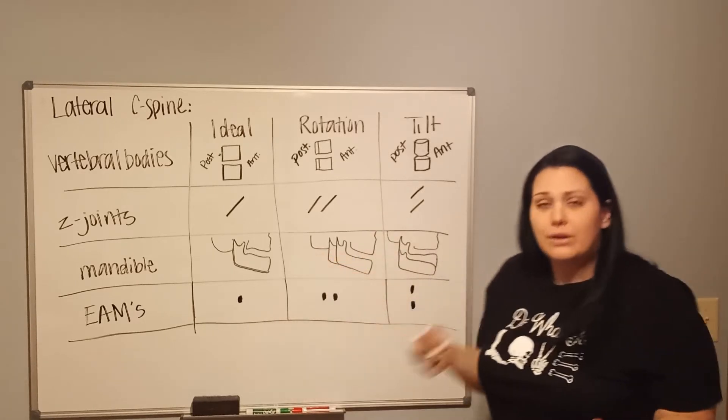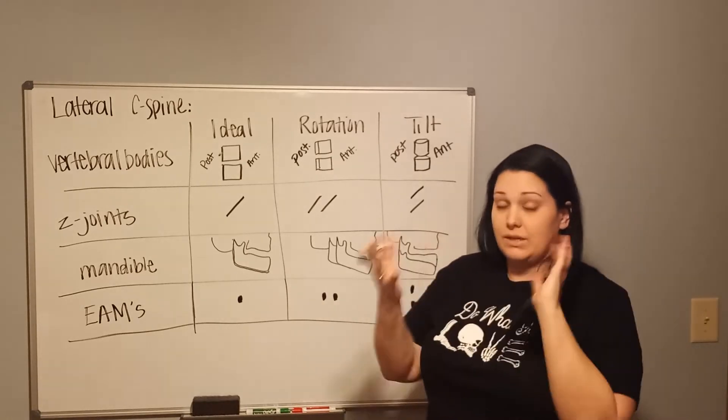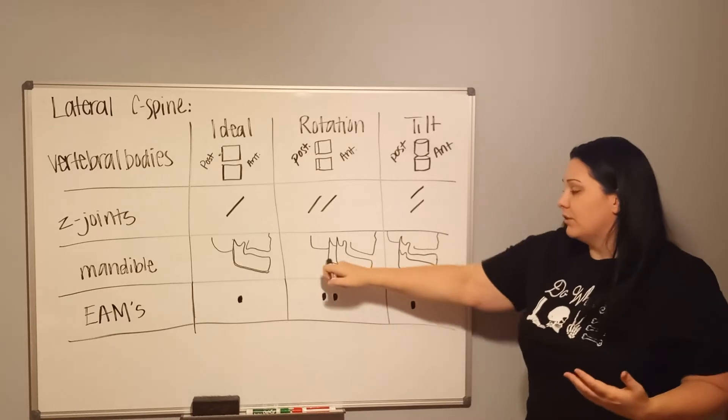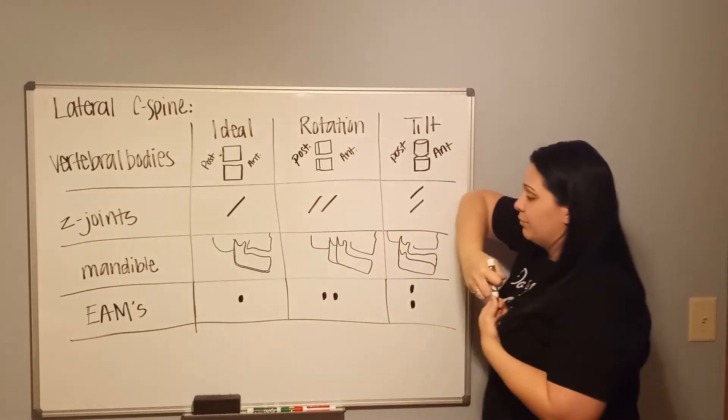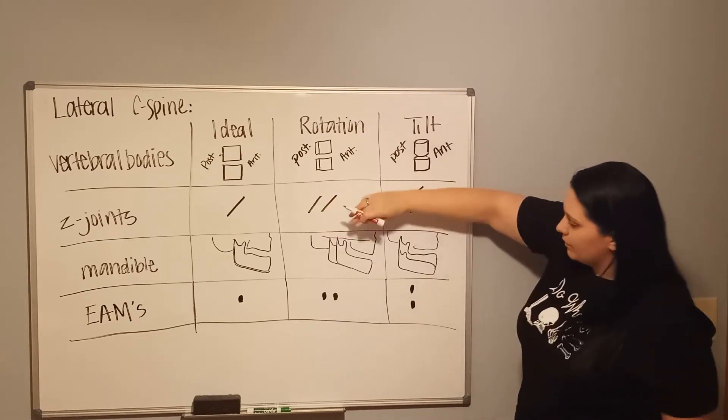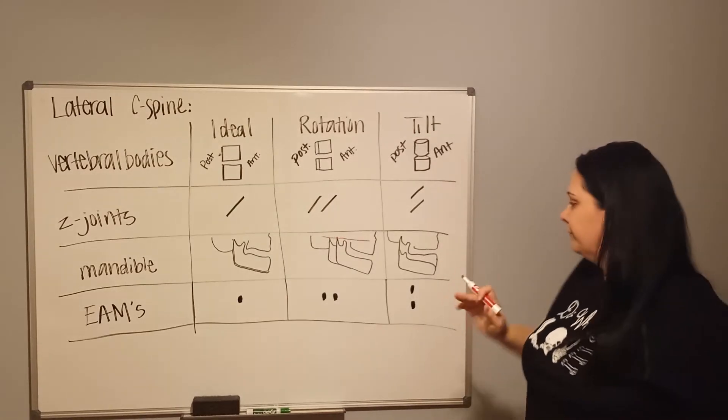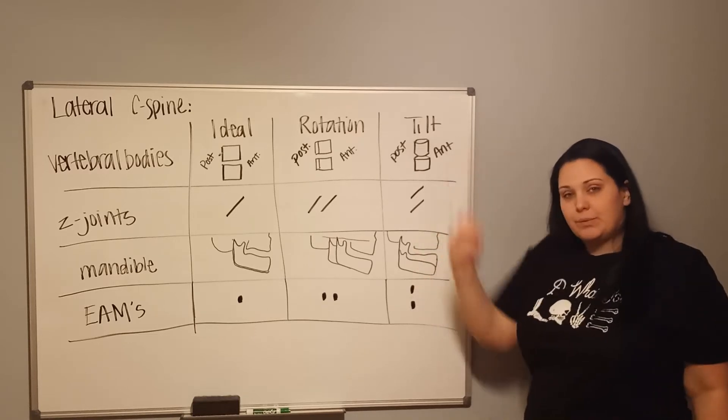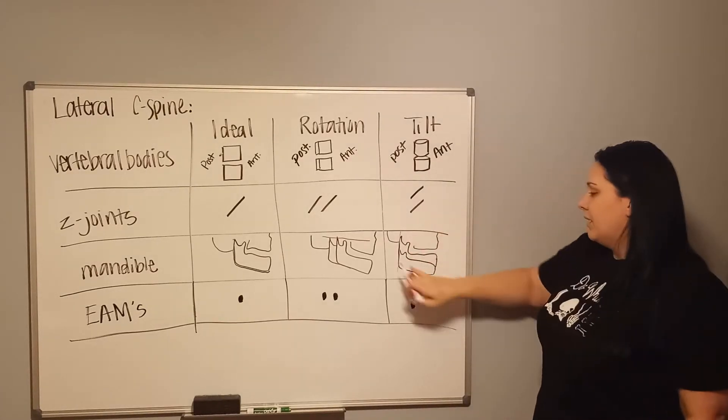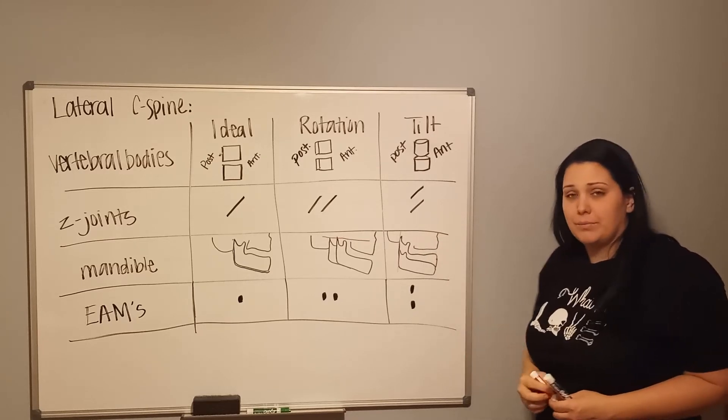Just like everything else we've talked about so far, you can tell rotation or tilt displacement based off of how each side, the bodies and rami of the mandible, how are they related to one another. If one's anteriorly or posteriorly situated but they aren't living on the same plane, and by that I mean I could take a horizontal line and draw it over the tops of them, if they both hit that line, that would be not tilt but rotation.